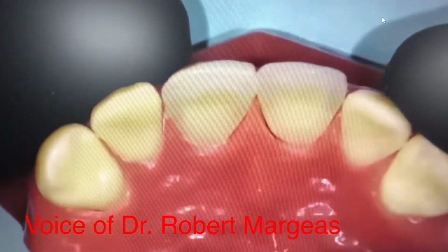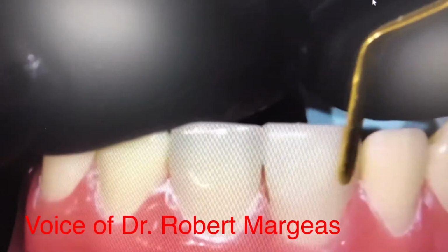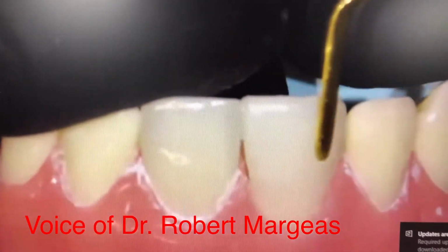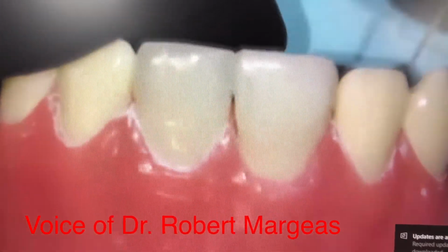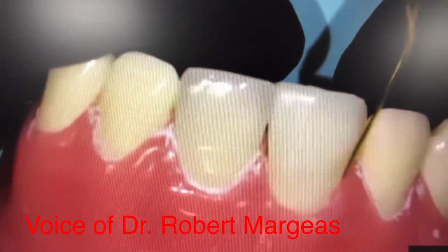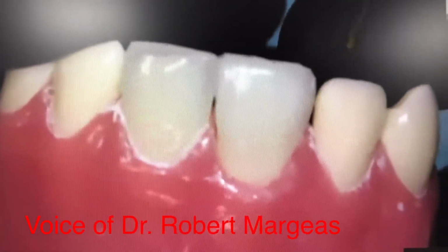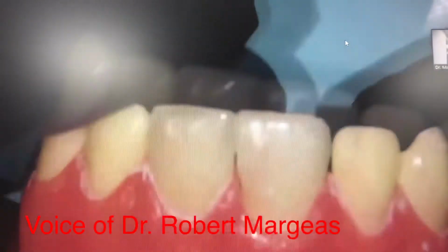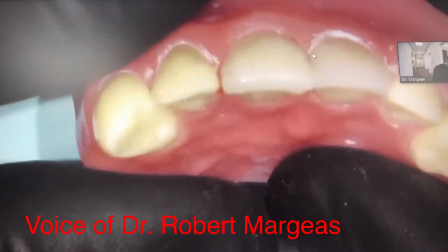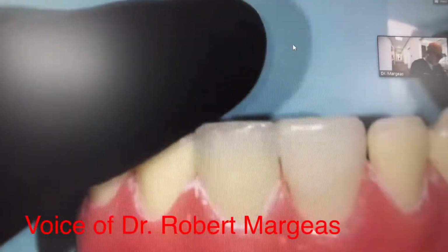So you can start to see what we're trying to do. All right? The material moves really nice, stays put, blending it into tooth, keep it out of the interproximal because that's not where the bevel was, so I can thin that out. And now I have a pretty good idea of the shape.